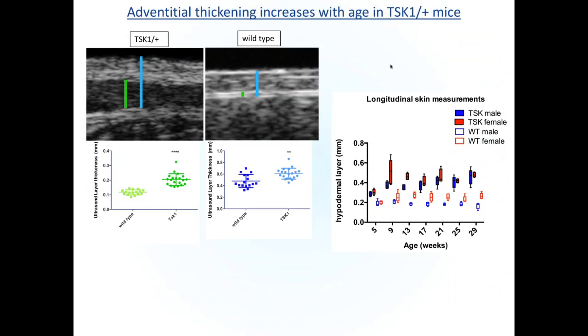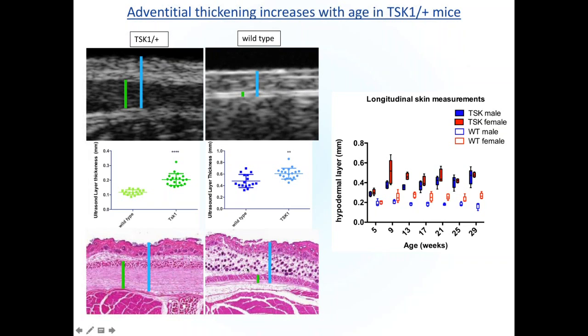So using the ultrasound imaging, first of all, we wanted to do some quantitation, and so we caliper barred two different regions. This was looking just at this aberrant band, the thickness layers. You could see significant differences in this region between the wild type and the knockout, and then also just measuring a deeper tissue layer from the outside of the epidermis down. Again, we could see significant differences. And again, these are our interpretations of what these measurements mean translated back to the histology images.